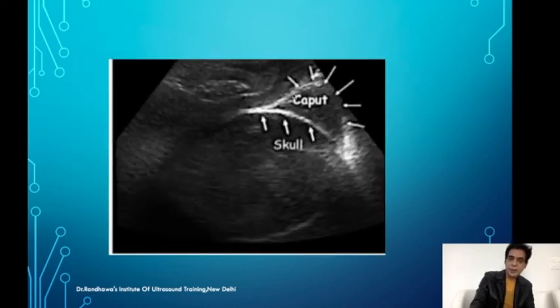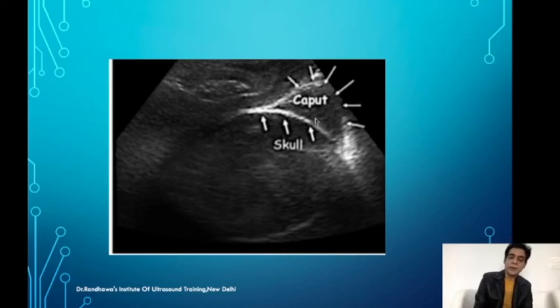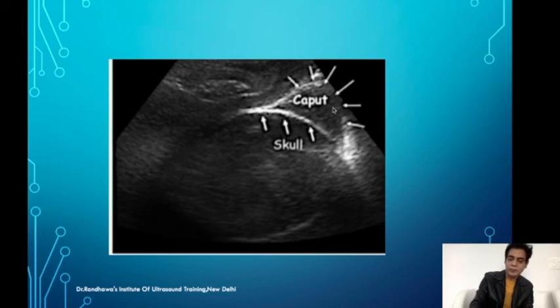In a case with caput succinadium, clinically you feel the head is at a certain level. But actually the bony part of the head is further up. So when measuring on ultrasound, we draw the line through the centre of the bony area — not the caput — and then draw the tangential line. That is why caput succinadium does not cause a problem in ultrasound angle measurement, because we are measuring the bony structure, not the soft tissue edema.